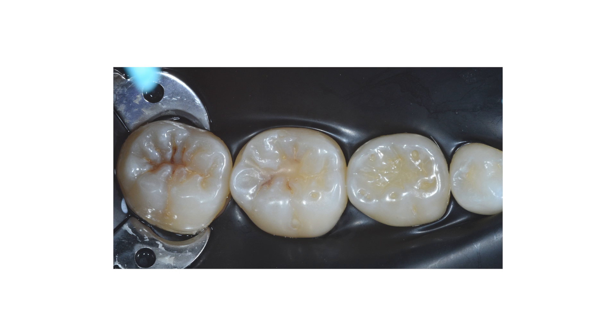Being non-reflective means it's not going to affect the vision through the microscope for these two specialties. I think that's a really important feature of this rubber dam, and it's definitely going to make a big impact in endodontics and minimally invasive restorative dentistry.